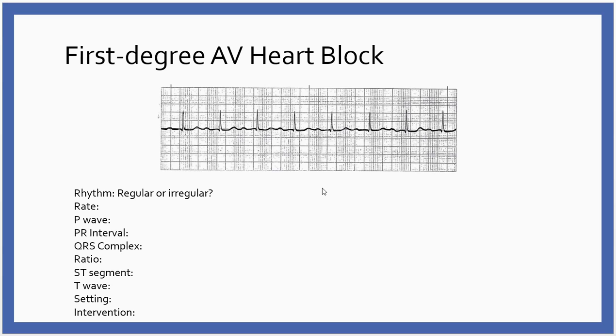All right, the heart blocks. Now, remember, in terms of testing, I won't test you on first-degree AV block. This is fairly common, so you're likely to see it. If you're looking at your packet, you'll notice that heart block is just a description for dysrhythmias where there's a delay or problem with conduction from the AV node to the ventricle.